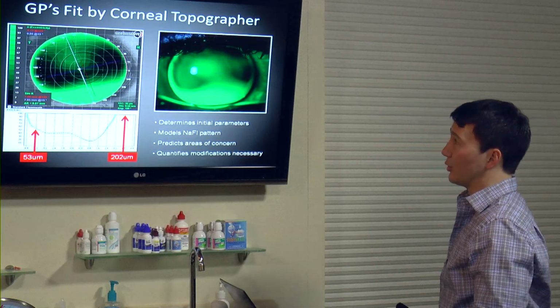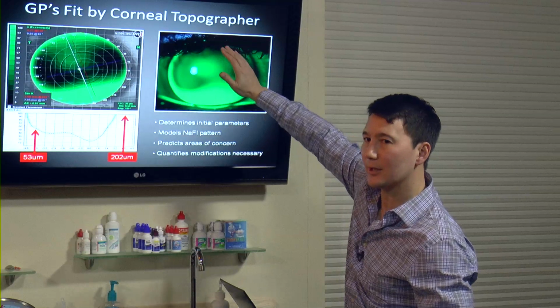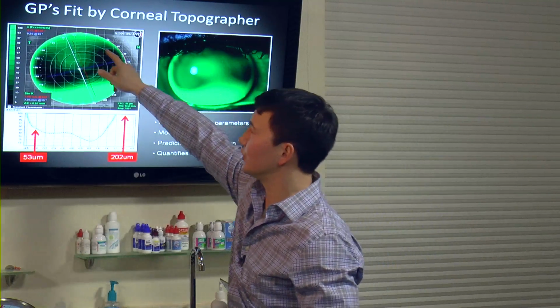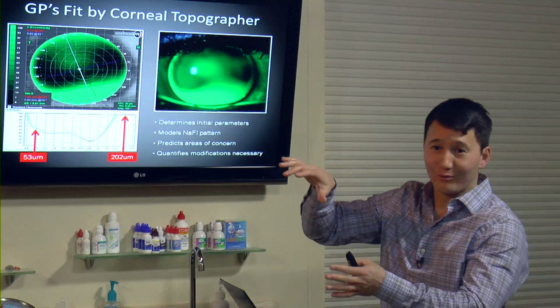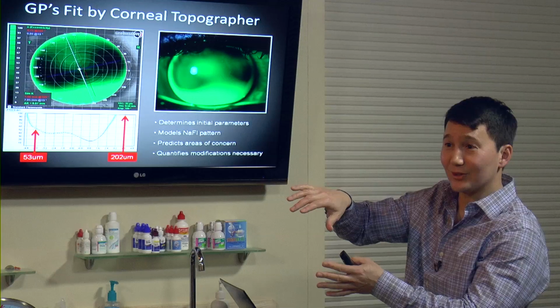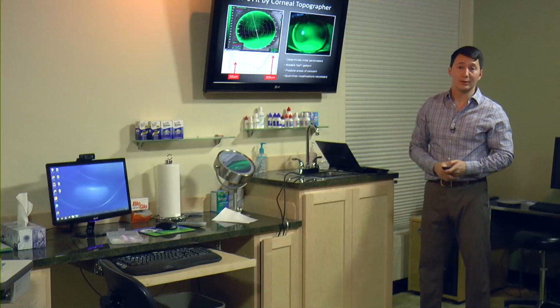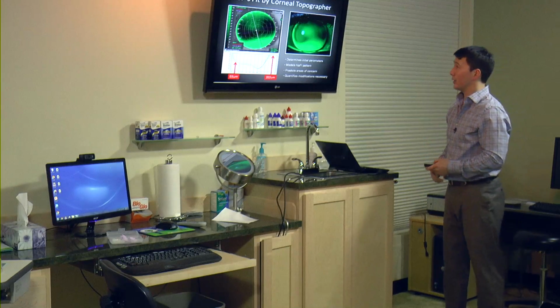So here's the actual lens we put on this eye, and you can see how the two match. This is a keratoconic, a very advanced cone, and you can see how the two match. The only difference is that we have lid force here pushing the lens, tilting the lens against the superior cornea, so you have this arcuate area of bearing where you don't see that on the theoretical lens. This patient was lucky. He had a smaller fissure and was able to support the lens at 12 and 6. For whatever reason, didn't get the bubble underneath it at 6 o'clock, so we didn't need to go with the scleral lens.